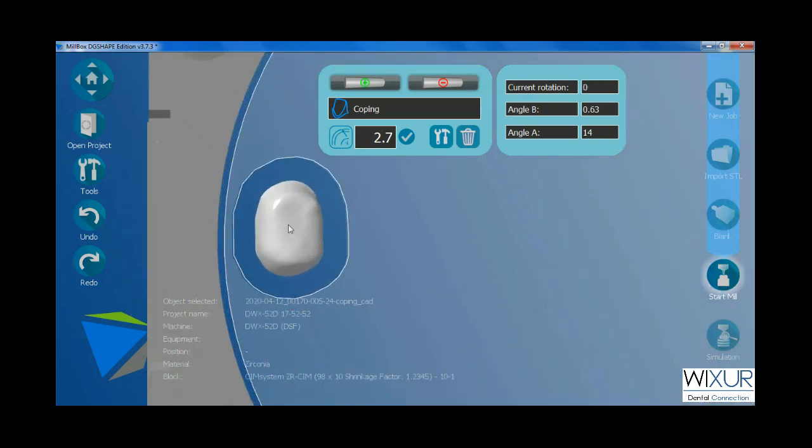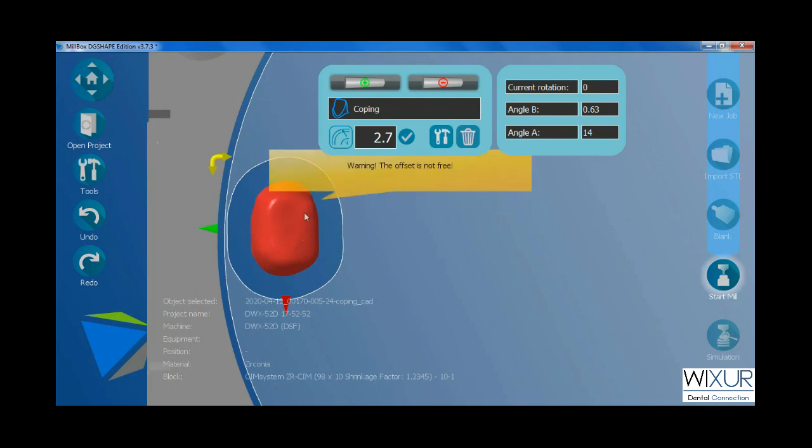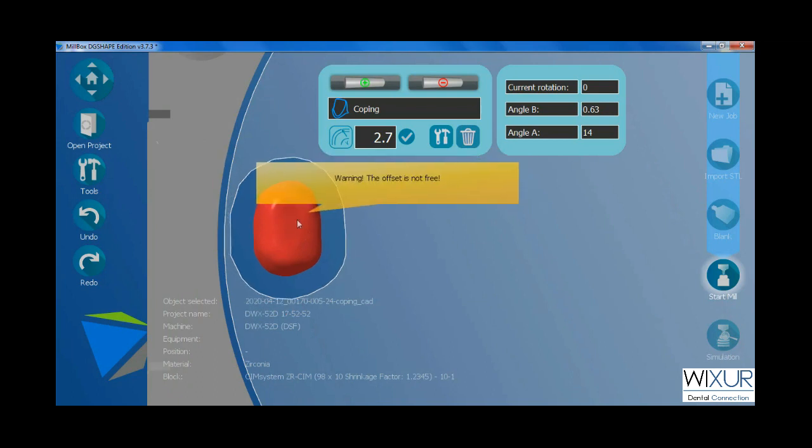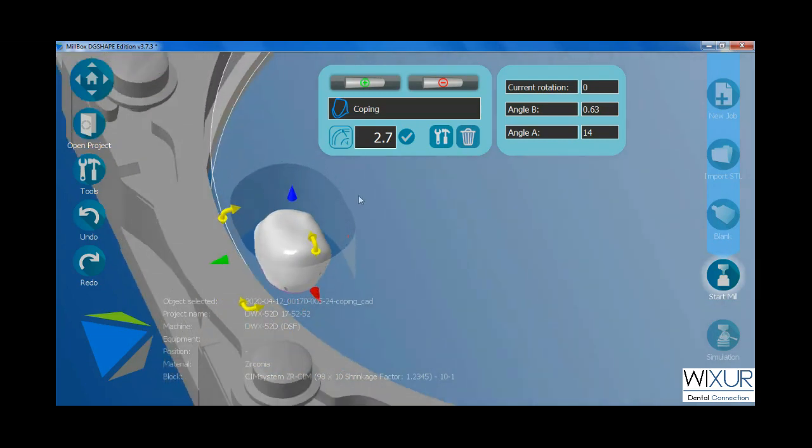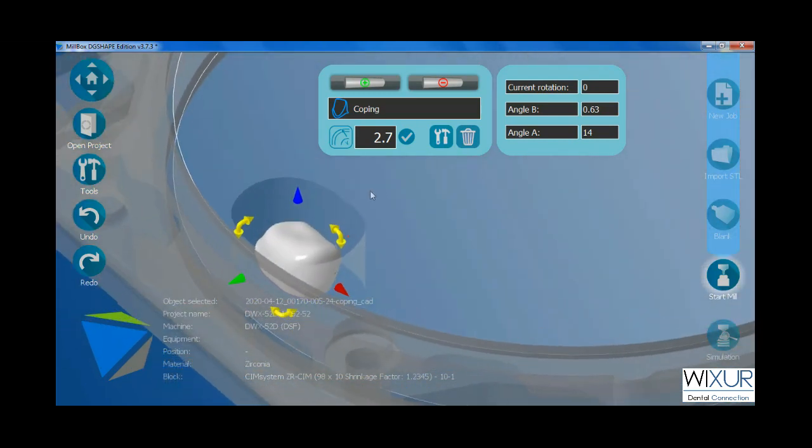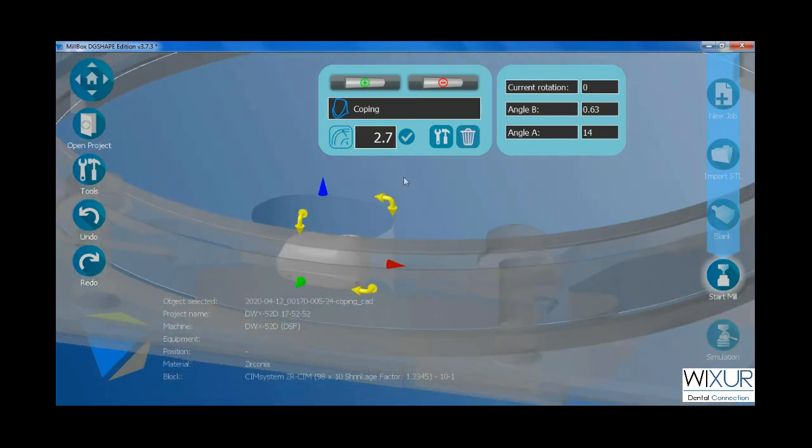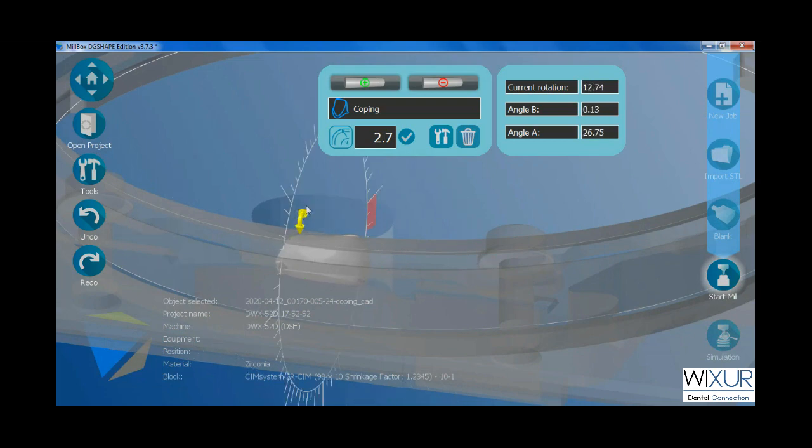Be careful not to place the crown too close to the blank's edge. The software also makes it red to show it is not placed properly. With mouse right click, you can rotate the blank, and as I said, use yellow arrows to rotate the crown.